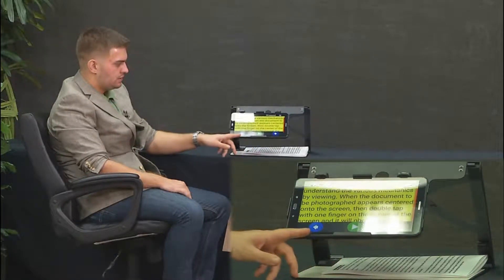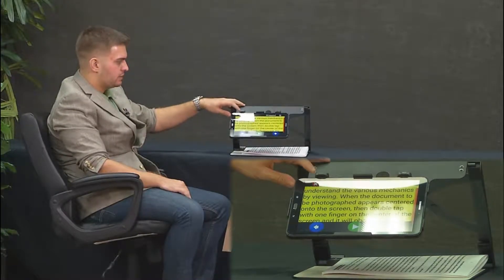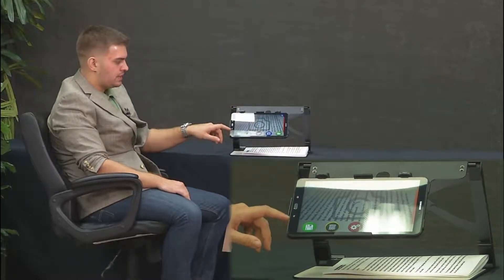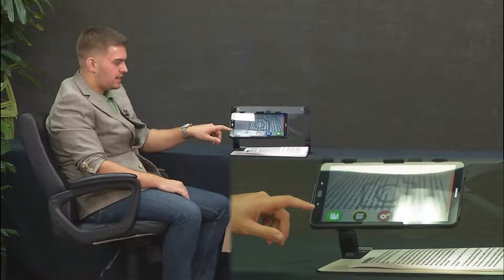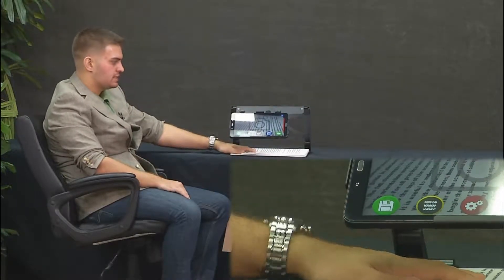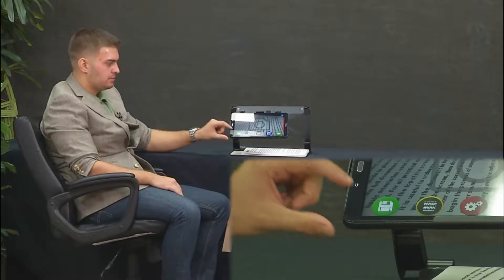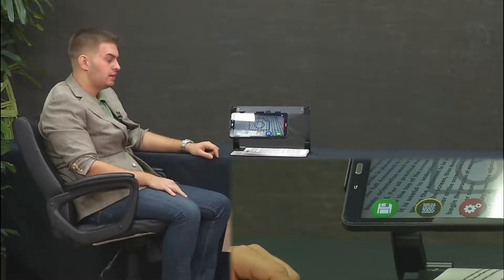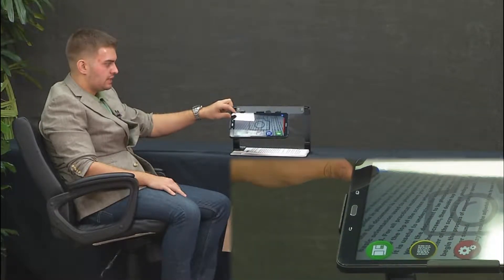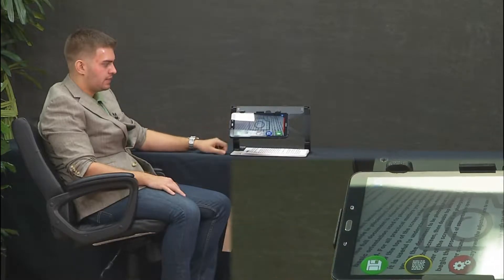You have pause and play in the bottom middle, and left and right arrows to skip forward or backward a sentence at a time. When done reading, press the X on the top left. The bottom left icon saves documents directly without processing them — just tilt up, press the button, flip the page, and press again to keep saving multiple pages. The top left icon toggles between the magnifier and reader.